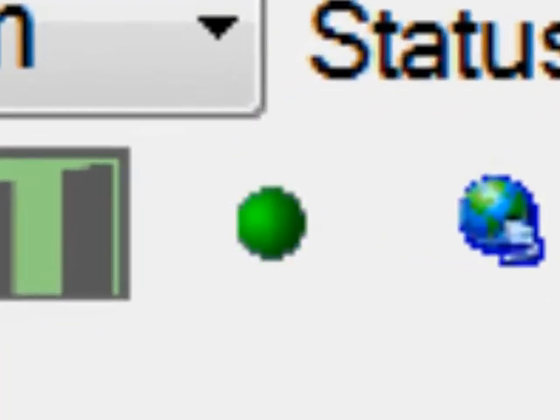The communications processing indicator is a system heartbeat that indicates three states: gray, that the application is idle; green, the application is processing data from the meter; or red, that the wireless link is disconnected and data is not processing.